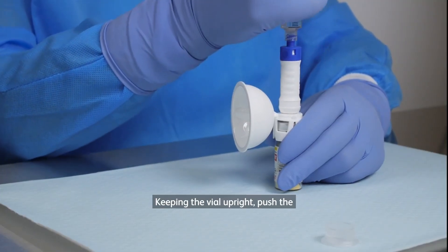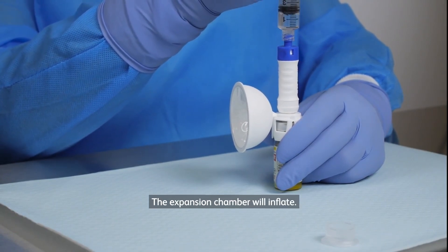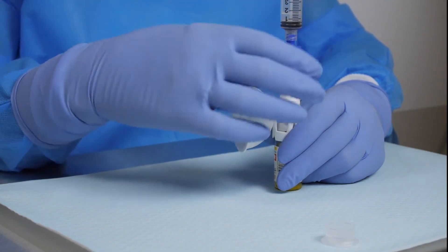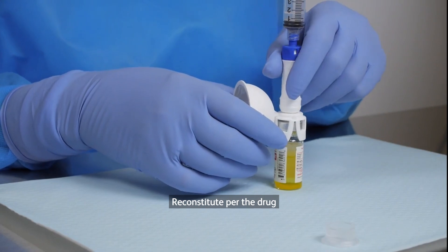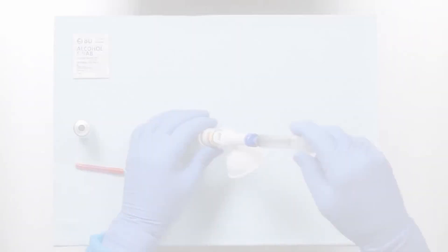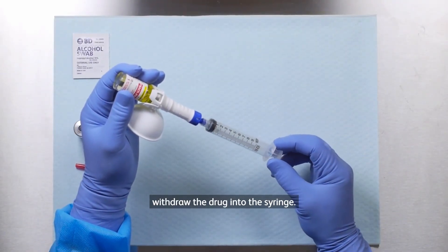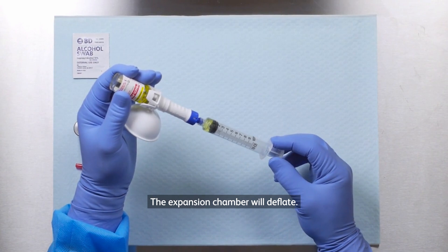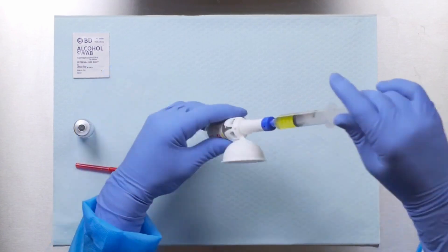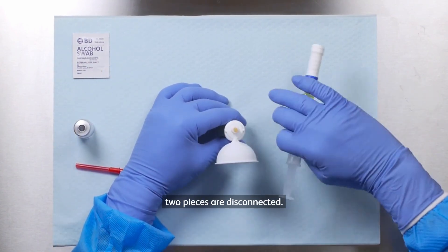Keeping the vial upright, push the diluent into the vial. The expansion chamber will inflate. Reconstitute per the drug manufacturer's instructions. Invert the system and withdraw the drug into the syringe. The expansion chamber will deflate. Pull the injector straight back until the two pieces are disconnected.